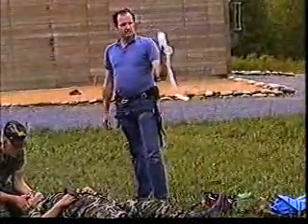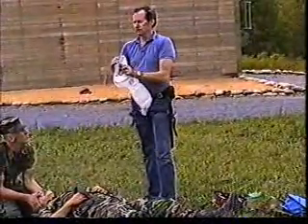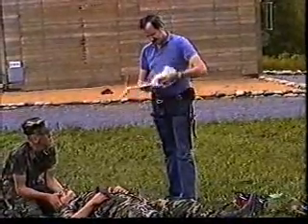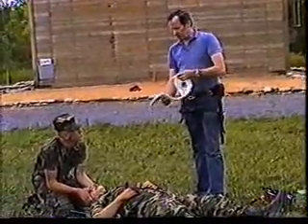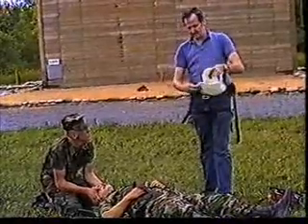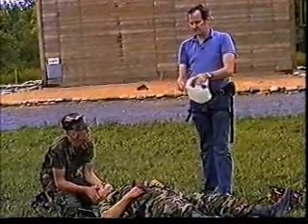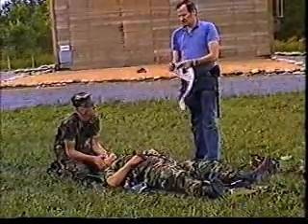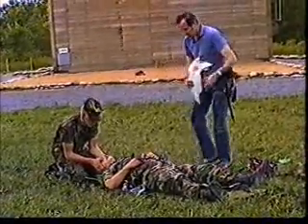When you're using a stiff neck, don't forget on this end, curl it in a little bit. The reason is when you bring this around, let me fasten this first. Okay, when you bring this around to tighten it behind his head, if you don't curl this in, this edge here can catch on it and you think you have it tight and it's not. So curl it in and it makes it easy to adjust. Okay.